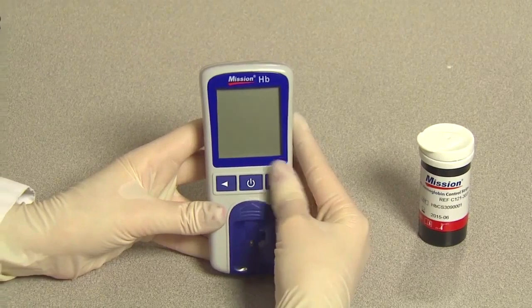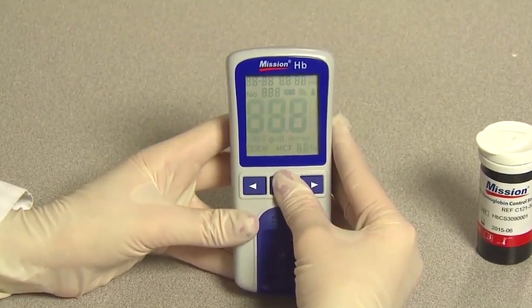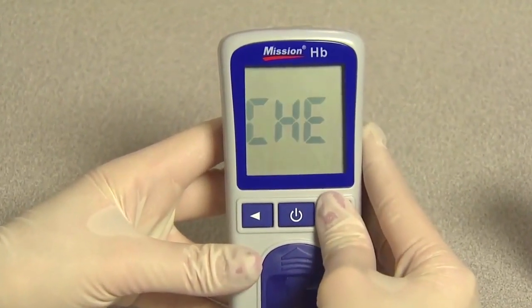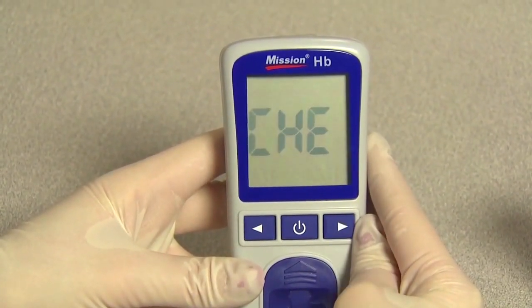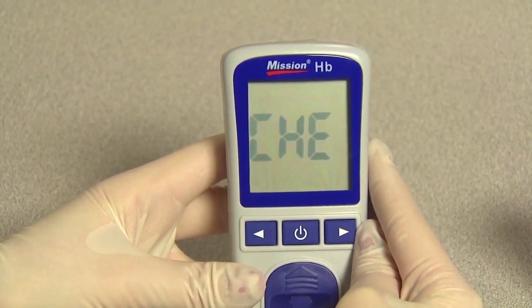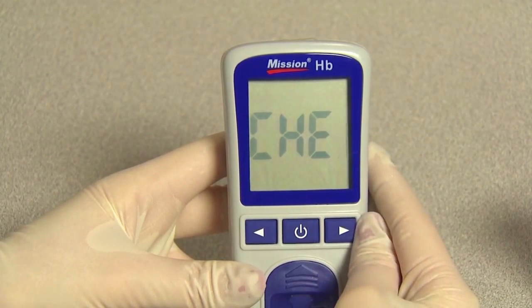To perform an optical system check, press and hold the power button for 4 seconds to enter the setup screen. Press the right button to navigate from the setup screen to the optical check mode, CHE. Press the power button to enter this mode. The meter will flash the test strip symbol.